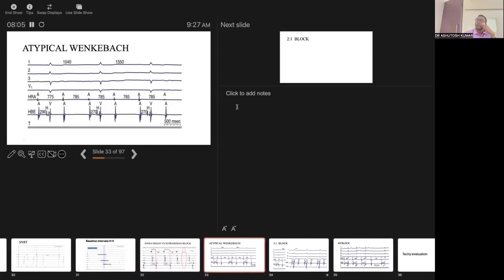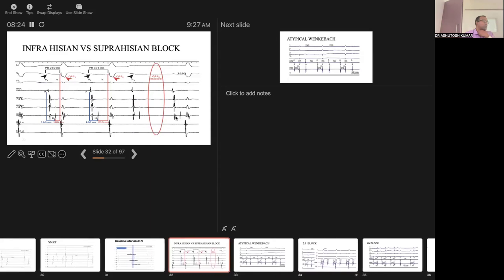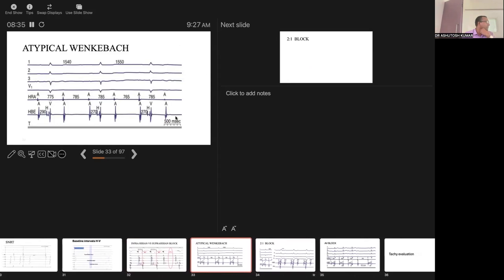And this? Identify na, AHV, A no H. Okay. AHV, A no H means which is good? This is good or this is good? Or if I have to say which is bad? And block is never a good thing. So this block is bad or this block is bad?